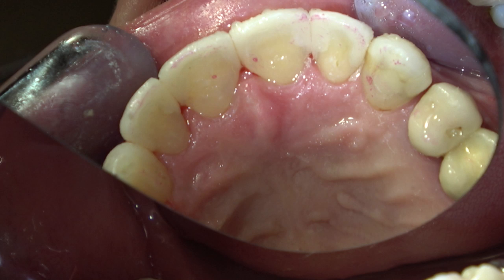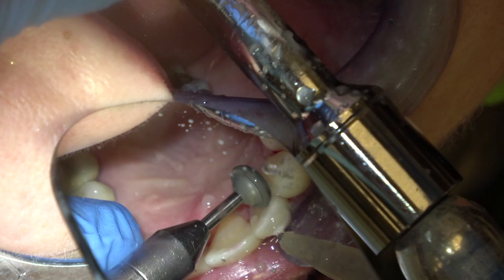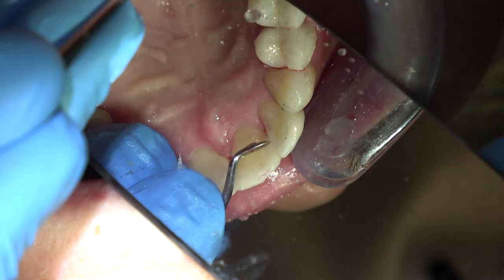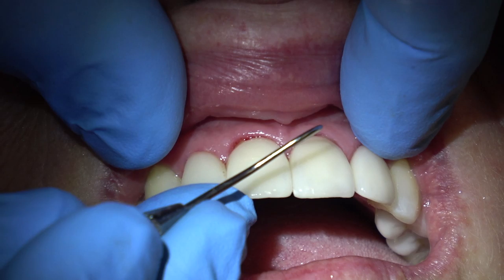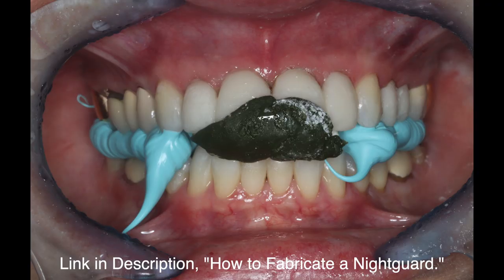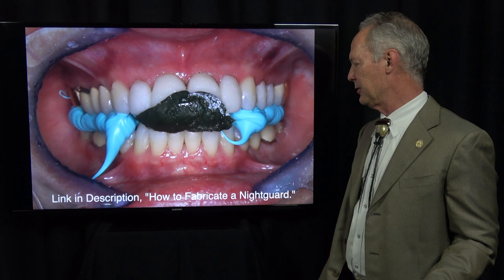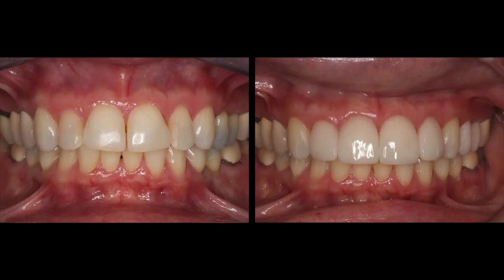Adjusting, and then using the Shofu rubber wheel to put a fine polish on the palatal of the veneers. Checking again with the round end of the amalgam carver. Be sure there's no edge. This is just checking the margins to be sure they're perfectly polished to the teeth. Then I'm taking this record for the night guard. And you can check that link in dentistrymasterclasses.com on how to fabricate a night guard. Very simple and effective technique. I call a night guard my investment, the patient's investment protector.